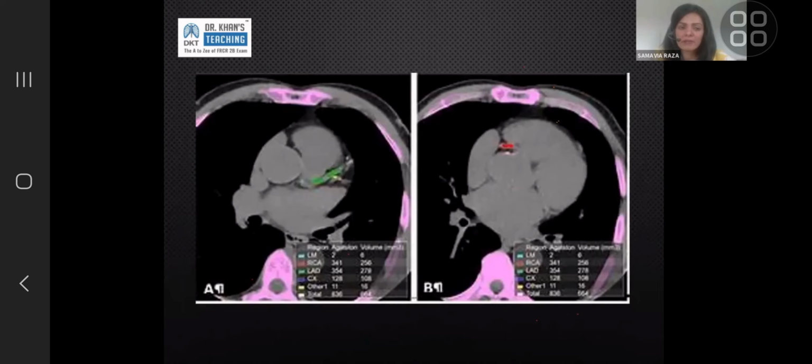The image interpretation software for cardiac imaging comes from two different sources. Some scanner providers have their own software, for example GE, Siemens, and Toshiba do. Some specific softwares are standalone programs, so you can buy them separately, for example TeraRecon and Circle or CVI. The standalone softwares are very good, and some providers prefer them based on how good they are.